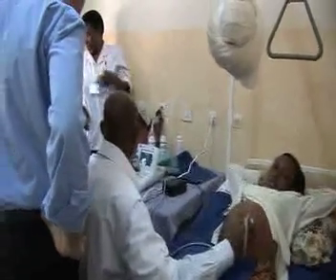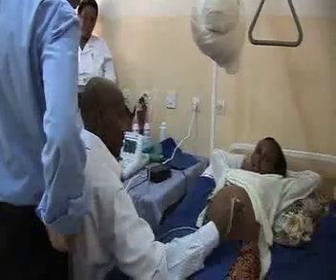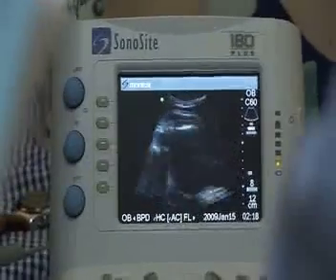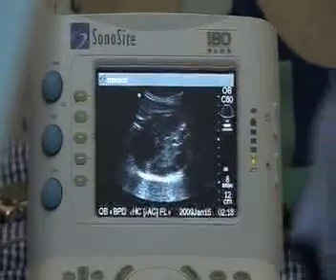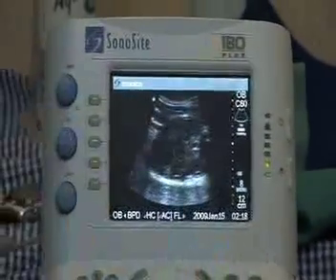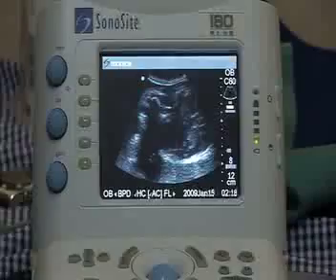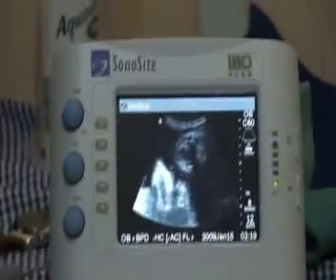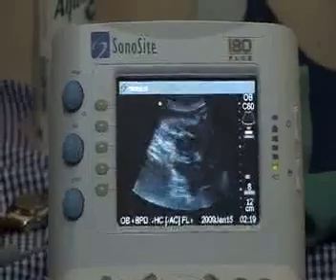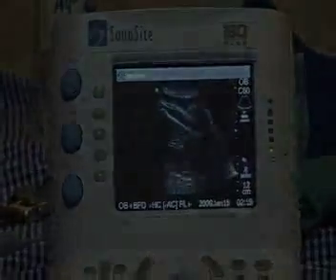Now we need one more. Remember always to see how the baby is lying. The bladder is there, so the legs will be here. So from here, just rotate — and you get one more view.